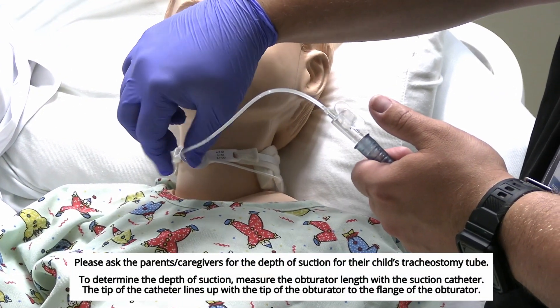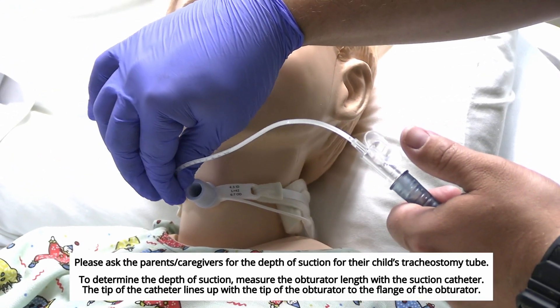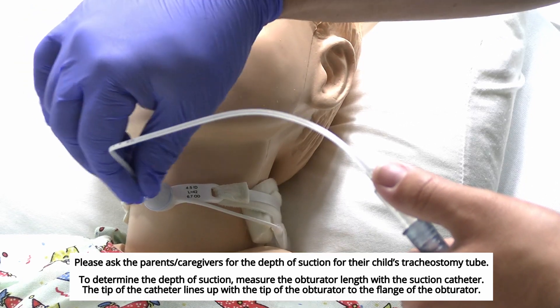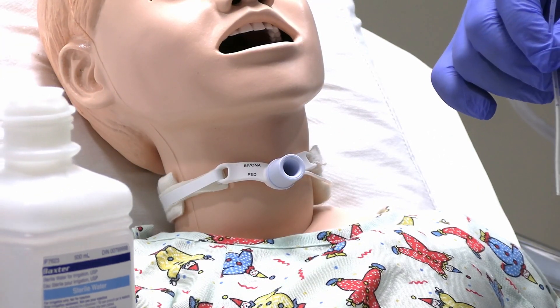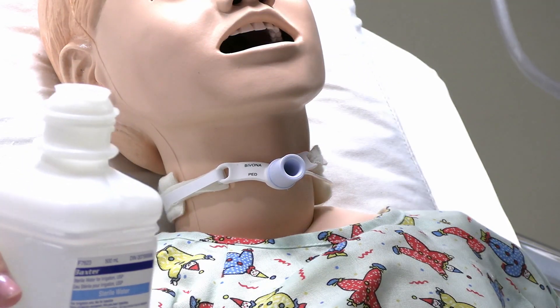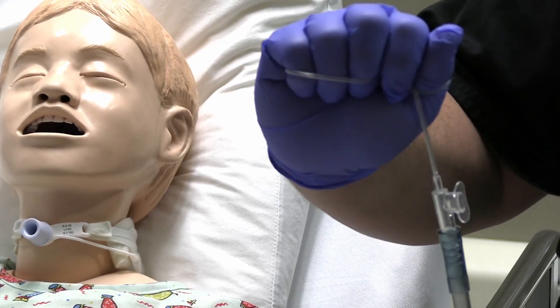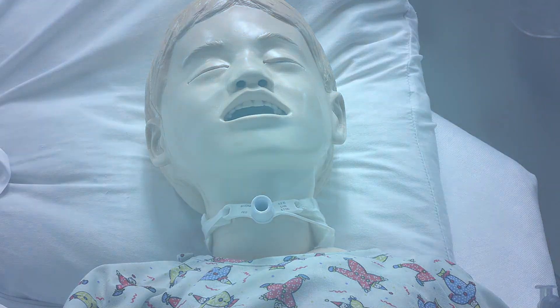Go ahead and advance that. If there is any resistance, give it a little twist to help advance it forward. Once you get to the point, apply suction and remove with a twisting motion. The whole procedure should take 5 to 10 seconds. Flush your catheter, lube it up, and keep it clean in your hand in case you have to do it again. Make sure you reassess your patient after each pass.